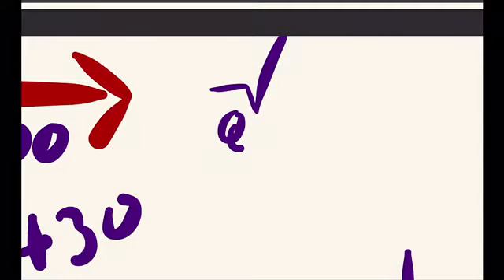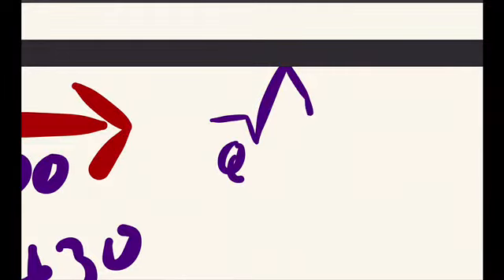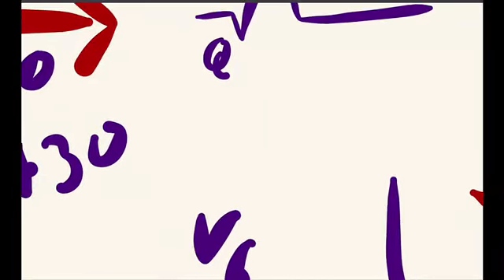Previously this ventricular depolarization was more, because the depolarization vector was going directly towards the V6 lead. Okay, and then the baseline was achieved. Now what will happen because of the right ventricular depolarization?